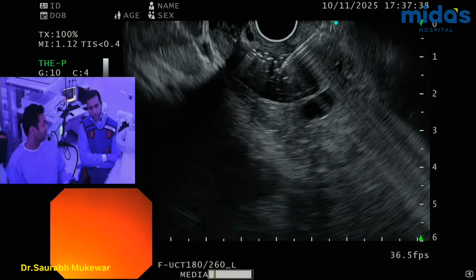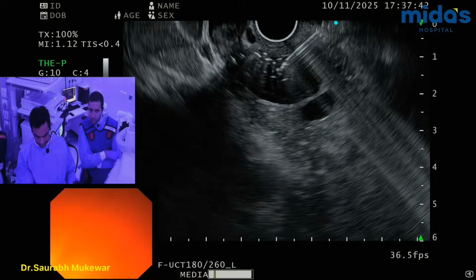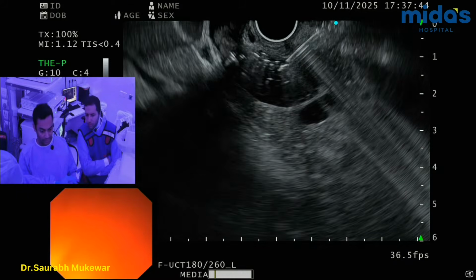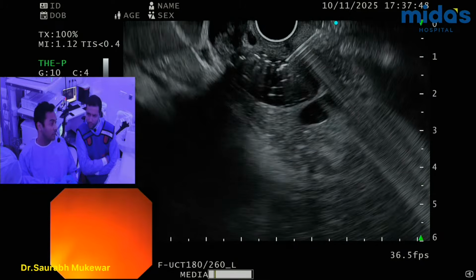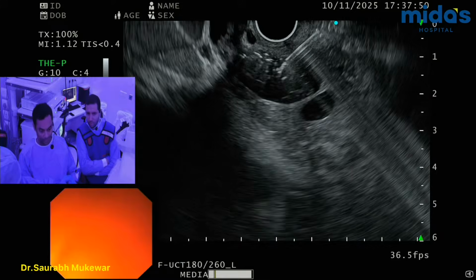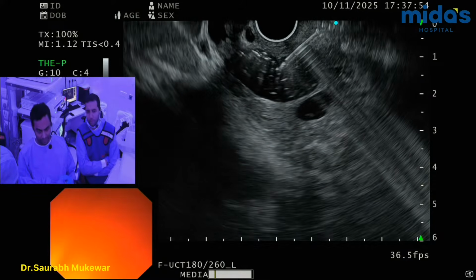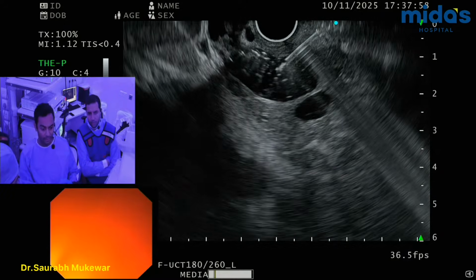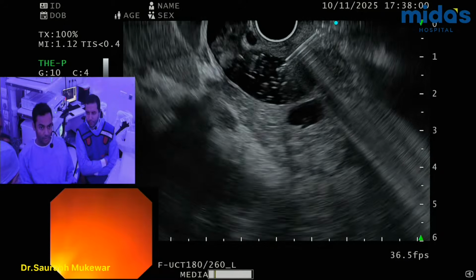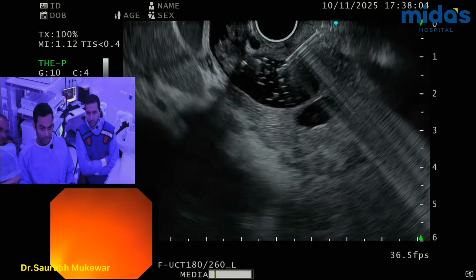You see that? So if I have to do it, then that's all, till the bend as much as I can and then come back. Otherwise I have to do hepatico-gastro or proximal part. I like CDS. Okay. So that was my question. Do you prefer? I prefer CDS. In this case, if I do hepatico-gastro and I really don't like CDS-wise, I have real problems then.